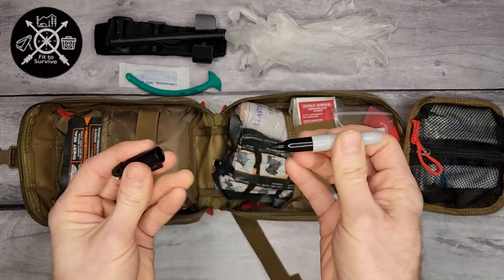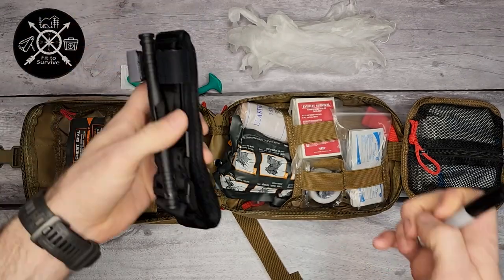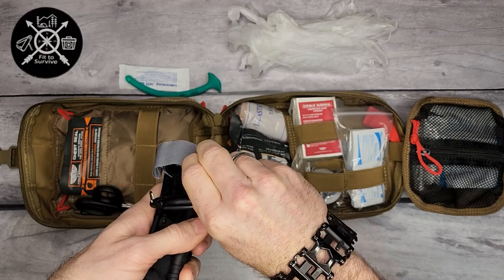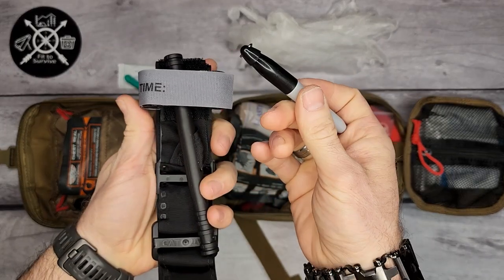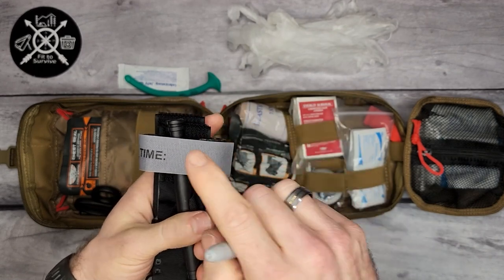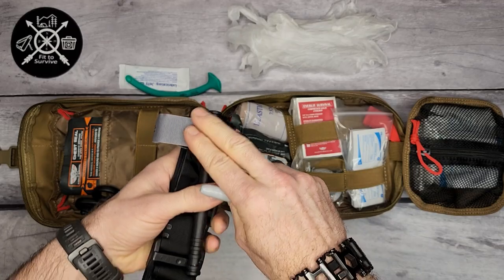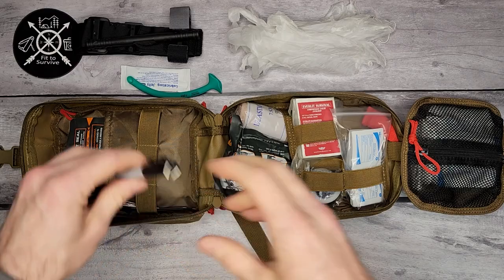It also comes with a Sharpie-style mini marker. When you apply a tourniquet, you need to write down the time it was applied. It's good that they included the marker here so you know how long the tourniquet has been on, because if you leave it on too long, you're going to end up causing more trouble than you're helping.